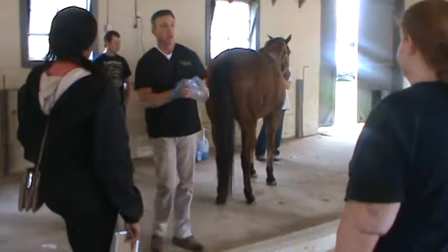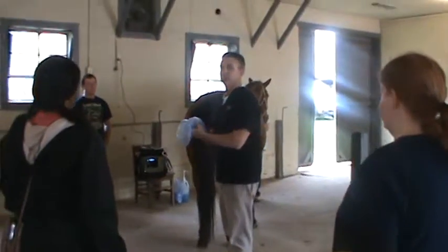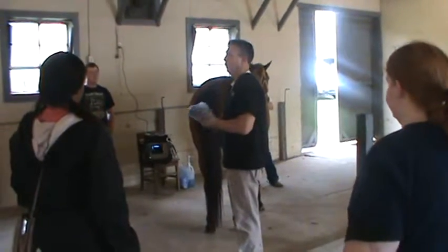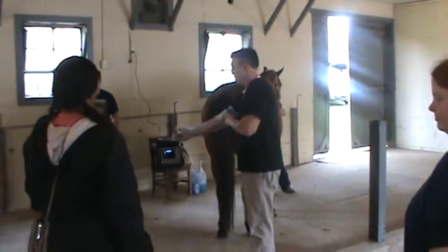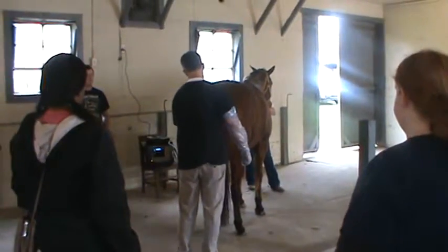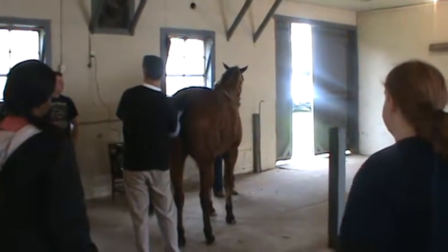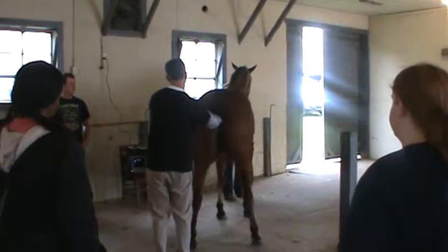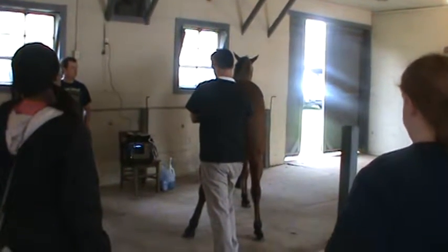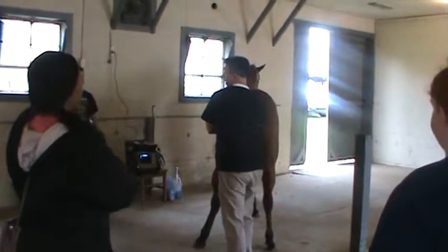So when you're palpating cows and breeding cows, if you pull your sleeve back and you get a little blood on it, what do your professors do? Right. Nobody freaks out. Nobody goes ballistic. You get blood on your sleeve, you're palpating a horse, it's a big deal. It's not a good thing. Okay. So horses do not tolerate any extra damage or irritation to the rectal lining as much as the cow. So if we damage that, it's something to be concerned about. Horses squeeze a lot more than cows.